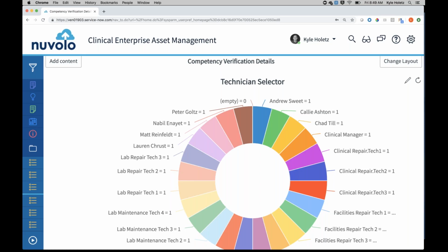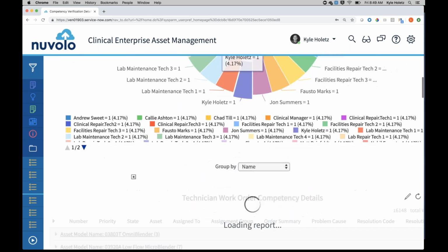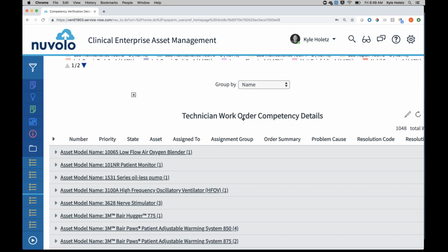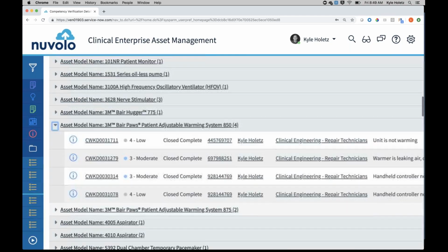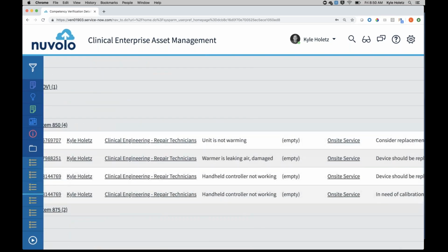This is just looking more specifically, right? The last report just showed by numbers how many work orders you completed. This report's just simply going to do the same, but it's going to show me by detail, right? So once it loads this report up, it's basically loading a number of different work orders that I've completed. So if I look at this one here, I can see a number of different things, right? I can look up the work orders, not only how many have I done, but what the close codes were, what the asset was. If I scroll over, what the short description was.